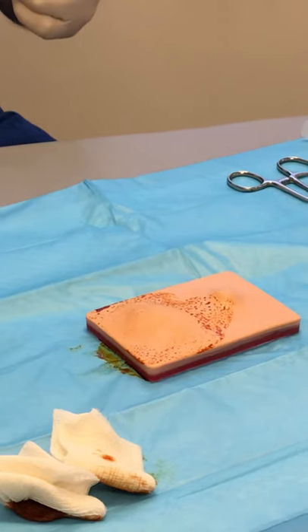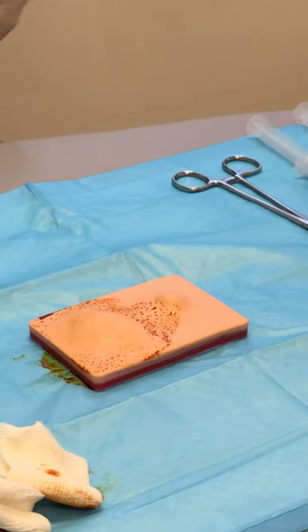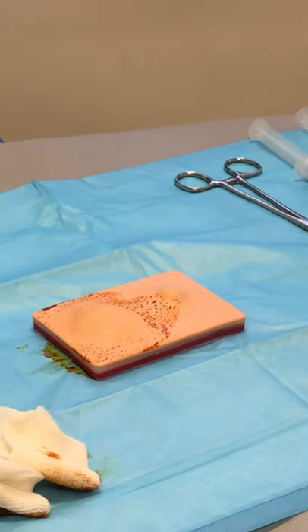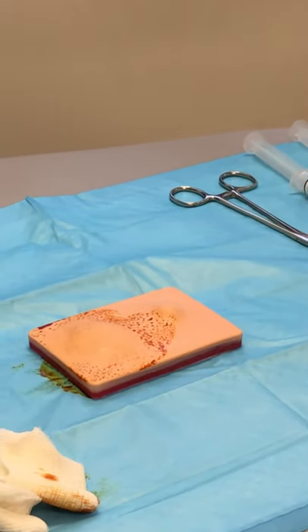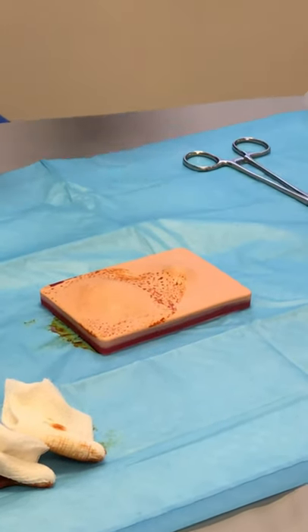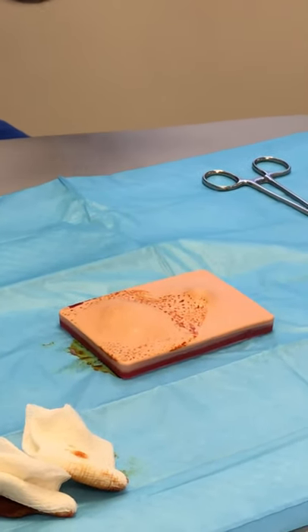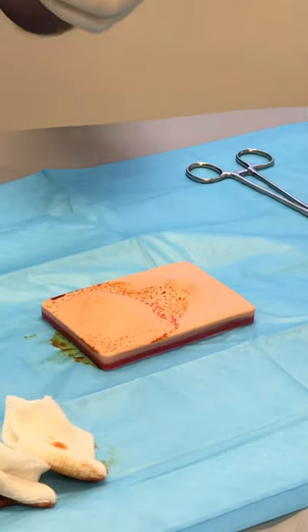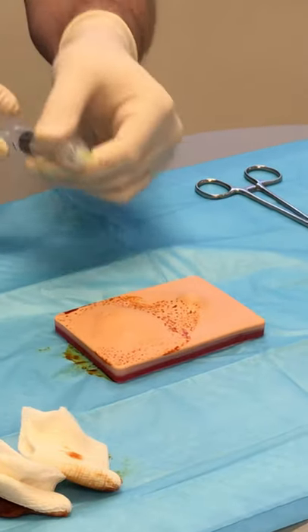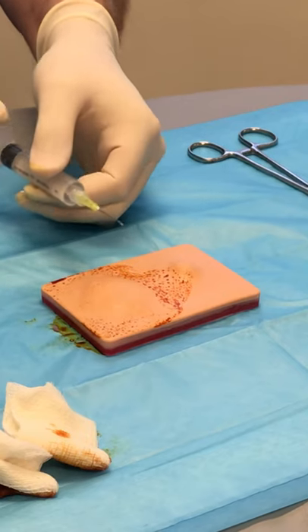When you're cleaning this thing, you can't push down on it too hard. In terms of incising — if it's in a cosmetically important area, you have to think about where the skin tension lines are. If someone has one in the middle of their forehead, you're not going to make a big vertical cut through it. You have to think about which way the skin wrinkles, and if it's on an extremity you're usually going to cut longitudinally. It's important to plan that out.